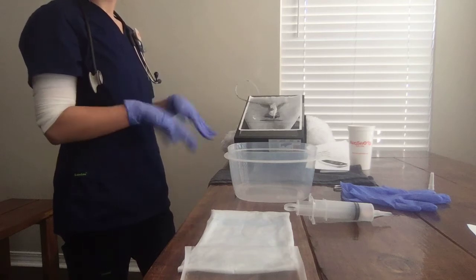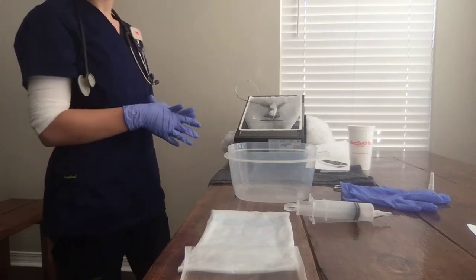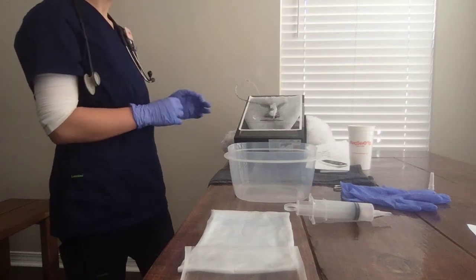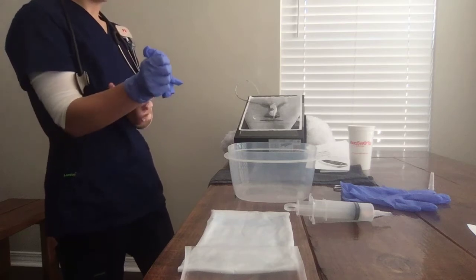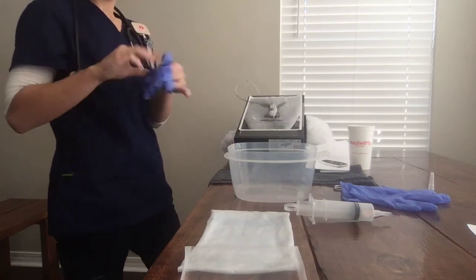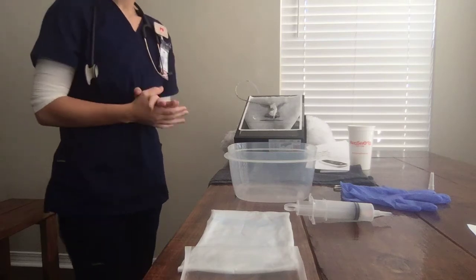I would lower the bed and raise the side rails back up. I would make sure the call light was in reach, and I would assess the patient's comfort. And then I would clean up my supplies. I'm going to take off my gloves, and I'm going to perform hand hygiene. And now I'm ready to document.